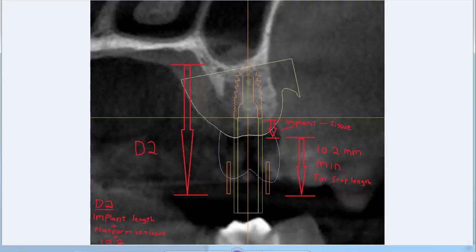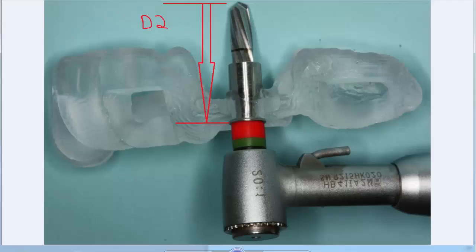You can always add a millimeter or two to increase your D2 length if you're not entirely sure of the distance from the crest of the gingiva down to the implant platform. Visually, once the drill stop engages the silicone stops, from that point to the tip of your drill is your D2 length.